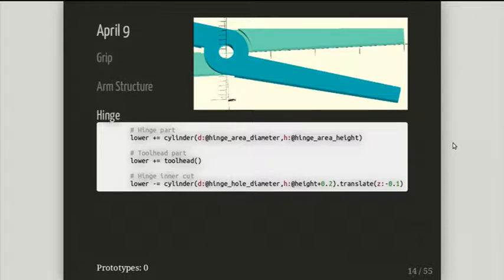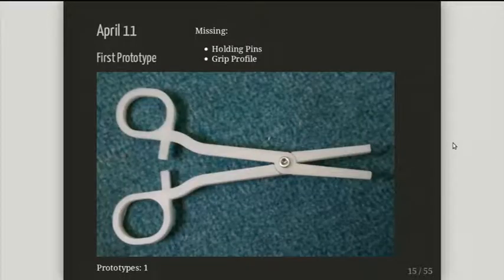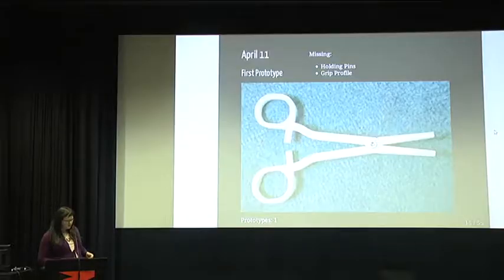I printed it out — I knew it didn't work properly, but I just wanted to see how it feels in the hand, whether the dimensions somewhat match, and whether I'd be able to use it. So I got the first prototype: it has a working hinge. The tool head doesn't grip, the arm shape was a bit off, and it doesn't have any locks — but you could hold it in your hands and see what's going on.